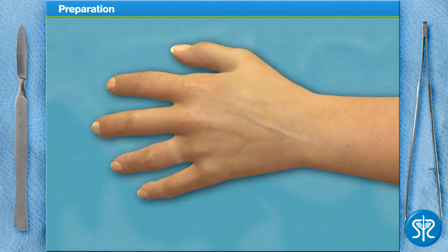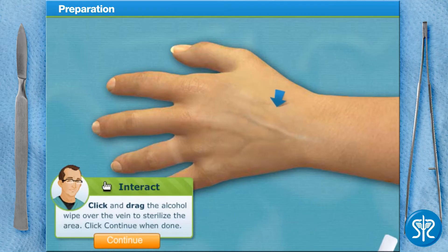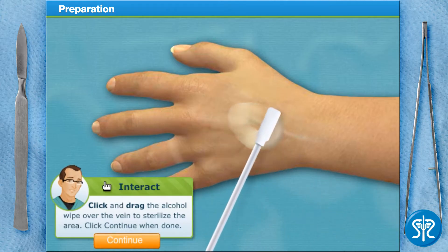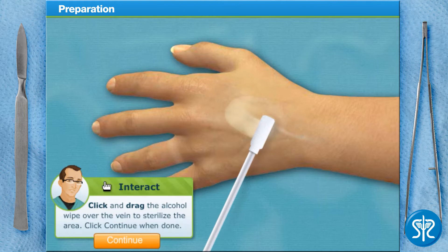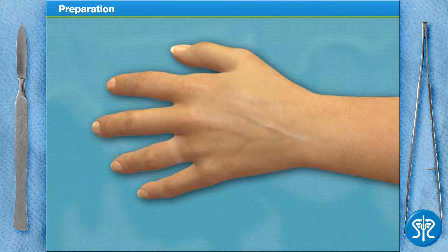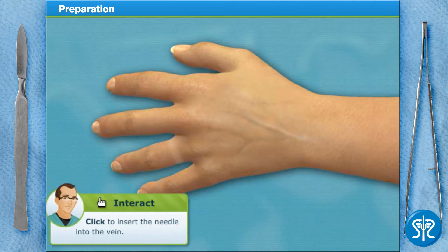Looks good to me. Next, we need to sterilize the insertion area using an alcohol wipe. Now that the area is disinfected, it's time to insert the needle and advance the angiocatheter into the vein. Take a stab at it.